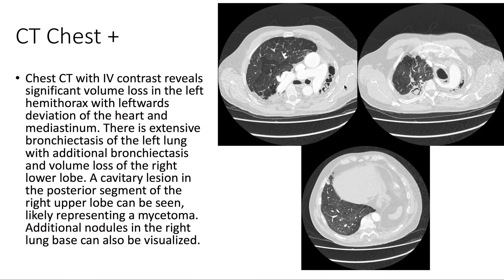On CT of the chest with contrast, we again can appreciate significant volume loss in the left hemithorax with leftward deviation of the heart and mediastinum. There's extensive bronchiectasis of the left lung.